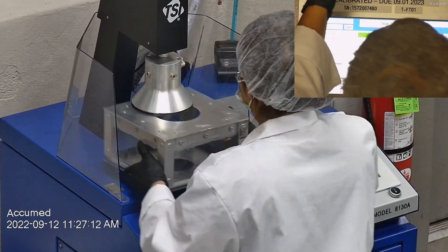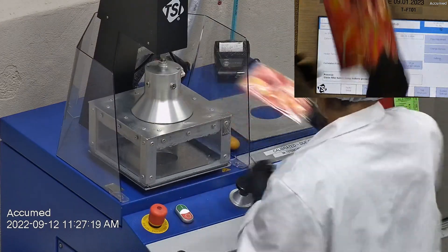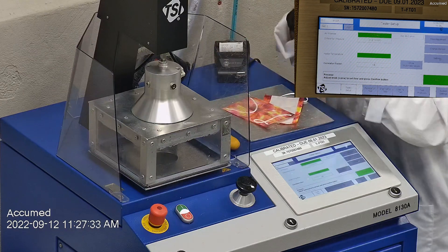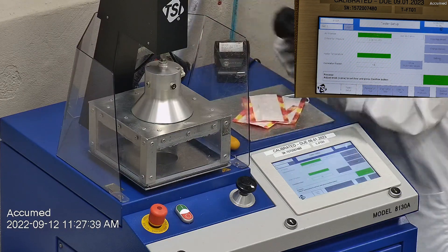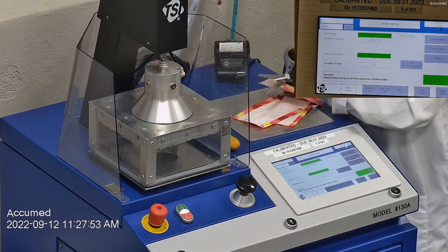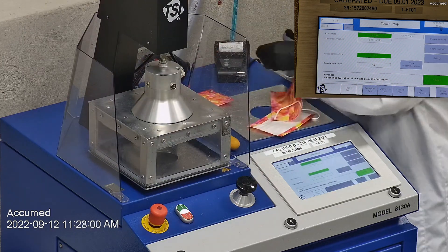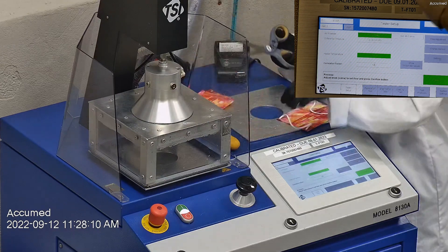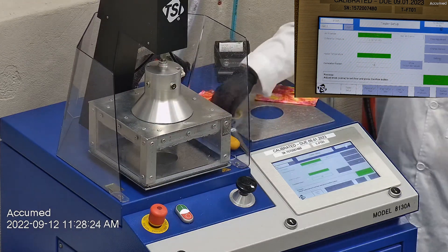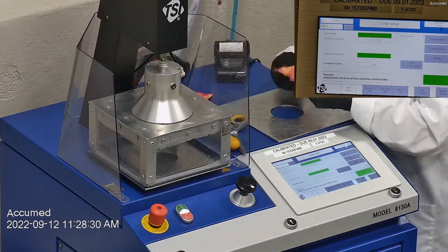Let's go ahead and test these on our TSI machine. We're going to be testing both the filtration percentage and the pressure drop. This is our TSI machine model 8130A, which is also the same filtration testing machine that NIOSH uses to approve N95 respirators. Our procedure is also inspired by NIOSH. We first run a tester setup and start removing the headband from the respirator before placing it onto the testing plate to ensure a proper seal.